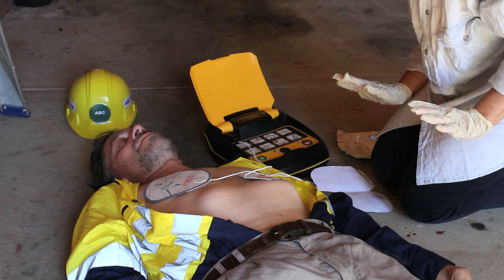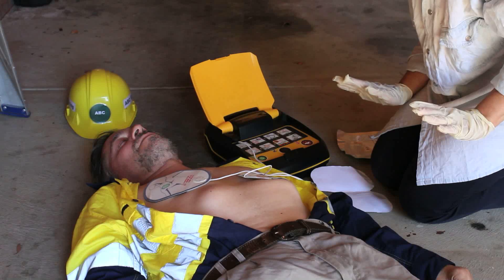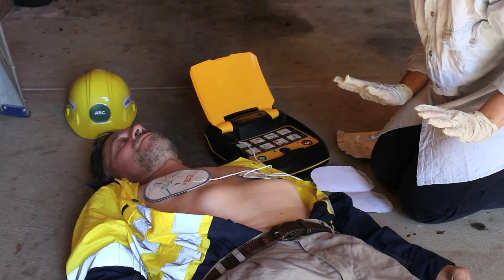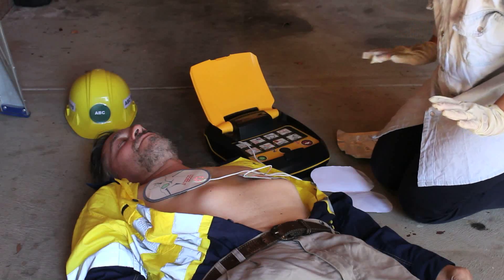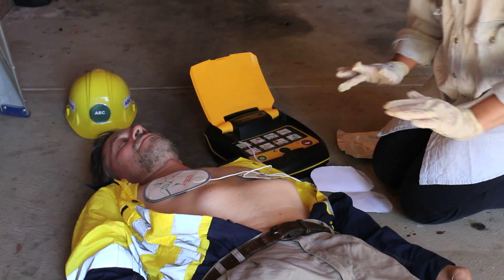Shock advised. Charging — do not touch the patient. Press the red flashing button now. Shock delivered. It is safe to touch the patient.